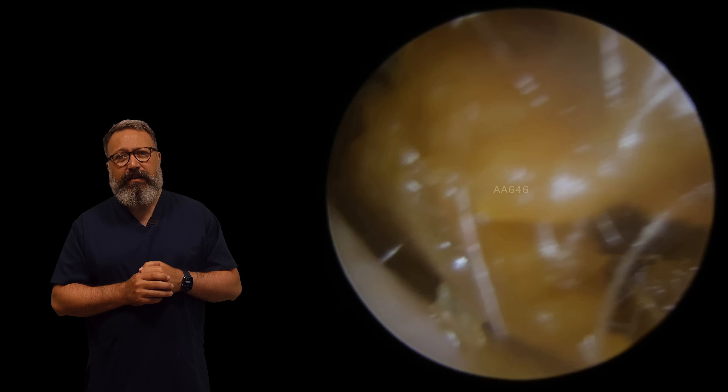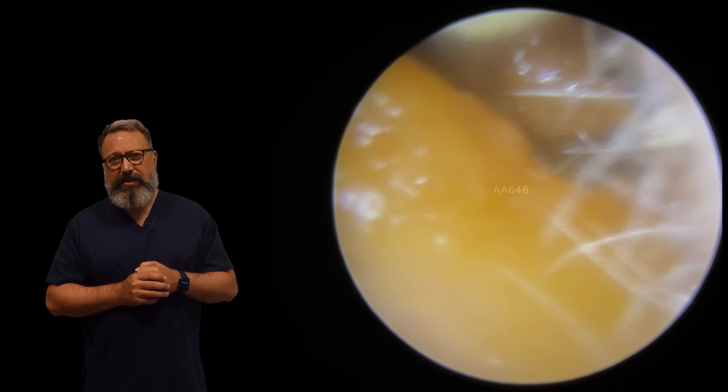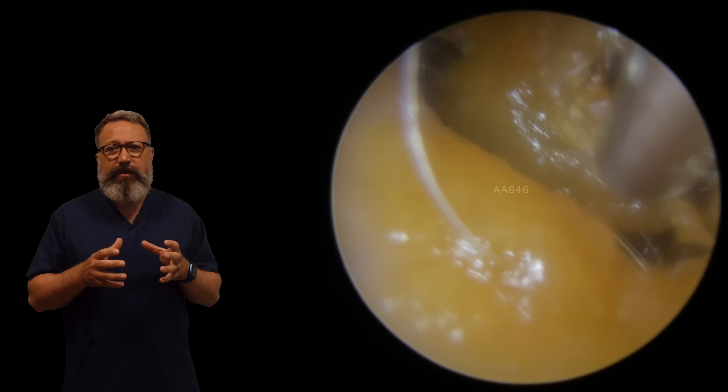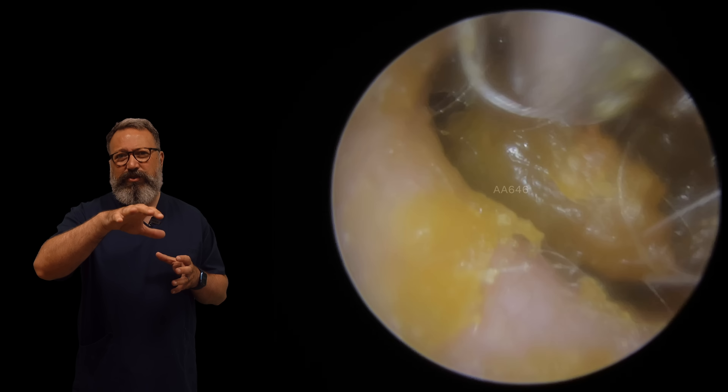We're on to the second ear canal here. You can see with this one it's very similar to the other side - this quite large plug here just on the outer part of the ear canal. So we're just going to get rid of some of this softer stuff at the entrance here.